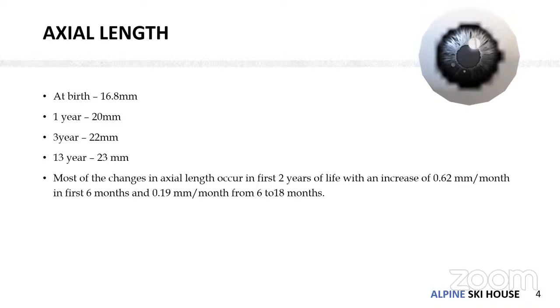In unilateral cataract, generally we tend to put the IOL much earlier. Say even at 6 months, 9 months of age, we can put the IOL if the eye size is okay. If the eye size is very small, for example, the axial length is less than 18 or 17, then it may be very difficult to put the IOL, and it is better not to put the IOL in such cases. But if the bag is of adequate size, then we can put the IOL in unilateral cataracts.